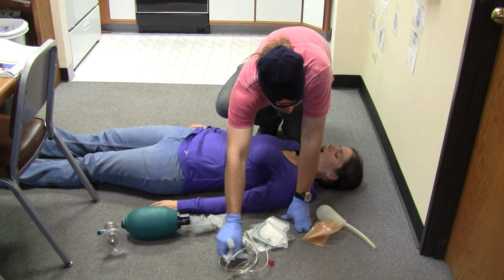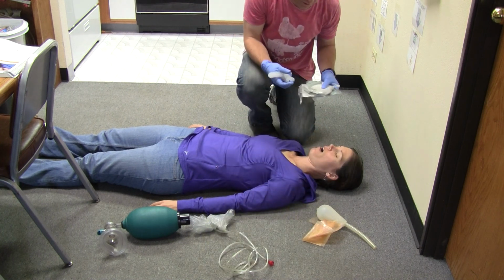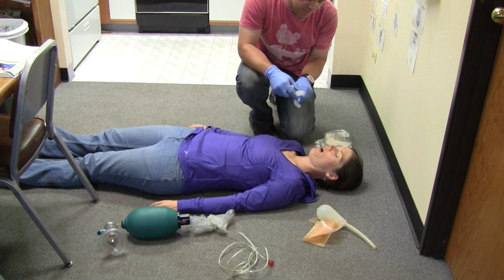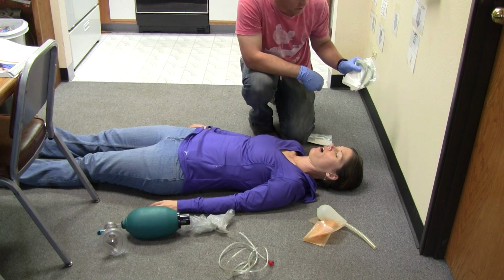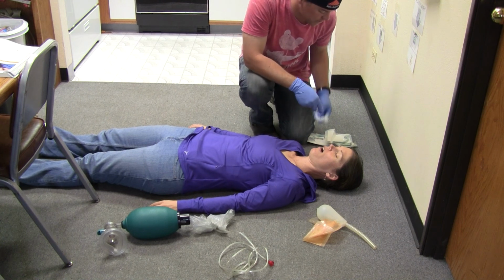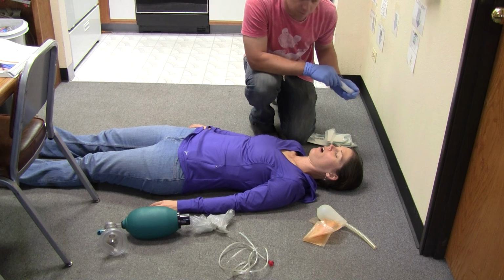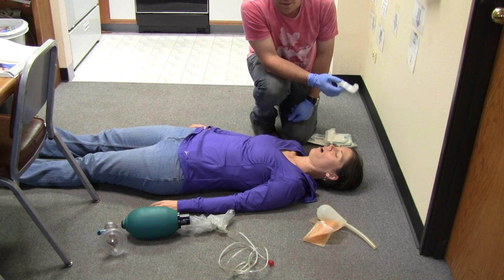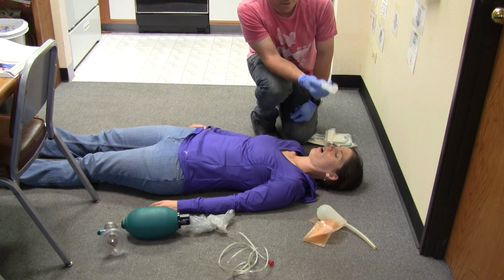Now that your device is suctioned, you have two options here to insert an airway. These are OPAs, or oropharyngeal airways. They come in different sizes. Or you have nasopharyngeal airways right here, the NPAs. An OPA is only used on a patient that's completely unresponsive. So you don't use it on a patient who still has a gag reflex. They will throw up. If you stick this in and they start choking, pull it back out, be ready for them to throw up, and put an NPA in instead.